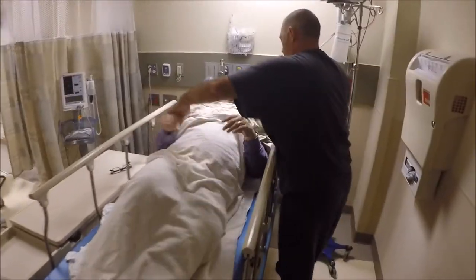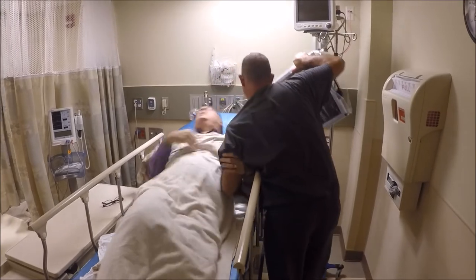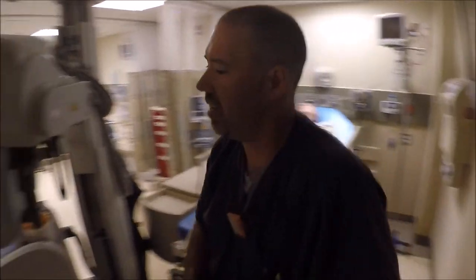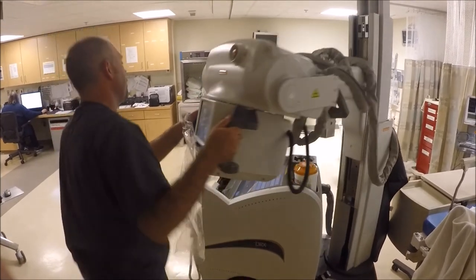Try to relax. We're going to get that board out. Reach up. All done. Try to help me here. Come back. All done. Let's see if we can get this done. We're going to do that. I don't think we missed. That's good enough. We're going.